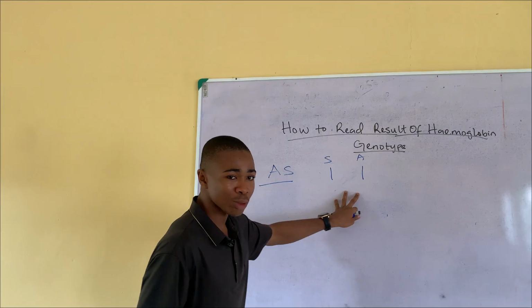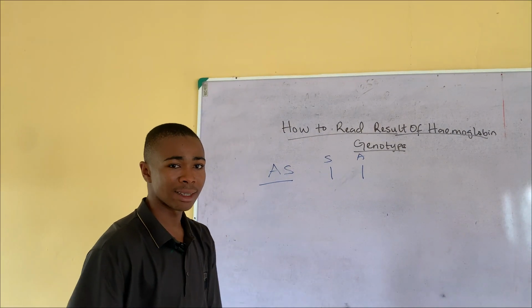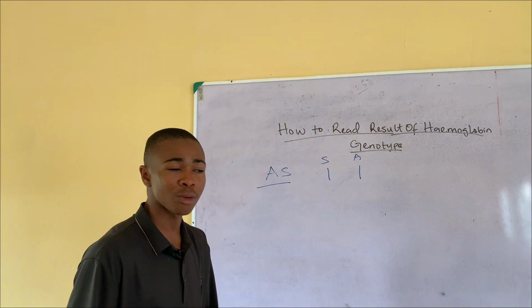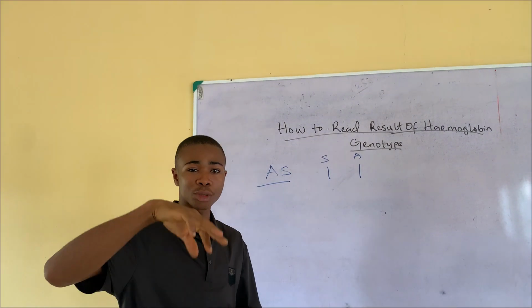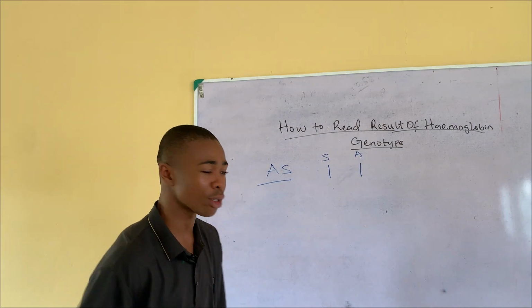This migration, as I earlier said, is based on the amino acids. If you know what an amino acid is, it's just like the end product of proteins. These are proteins actually, but it's like an end product of protein.